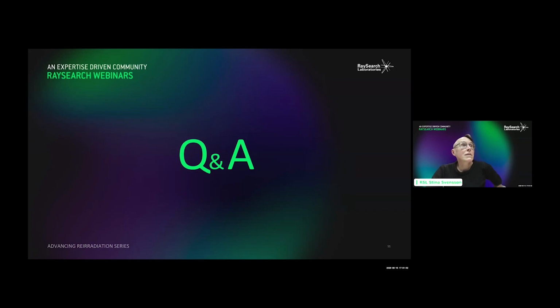Are you approaching some sort of protocol for how you do it in your clinic? I know, for instance, that we have this publication from the University of Michigan where they have published what type of recovery they use in a standardized way.